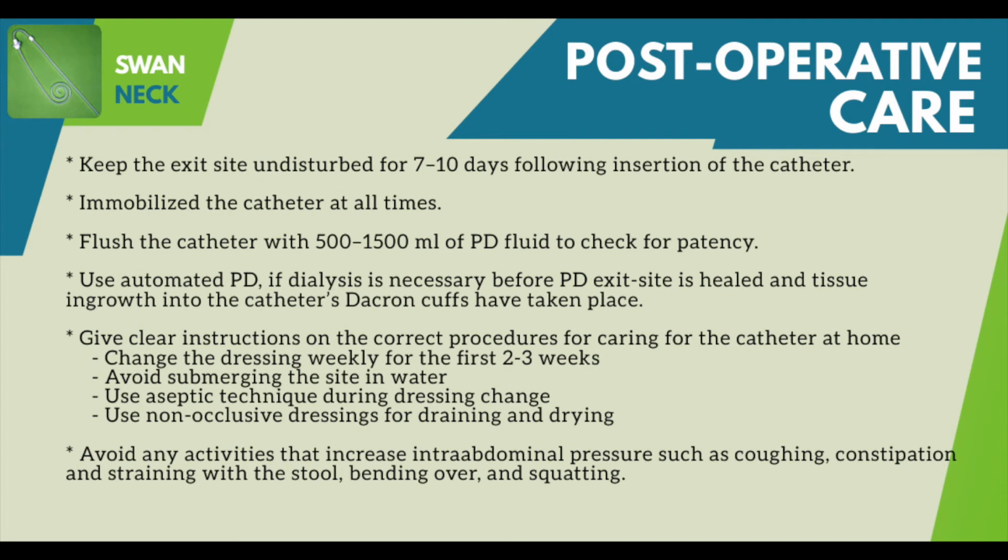Local unit policies will be in place and should also be followed. The catheter should also be immobilized at all times to prevent trauma. Flushing with 500-1500 ml of PD fluid is also necessary to check patency. This should be done directly after the insertion of the catheter.